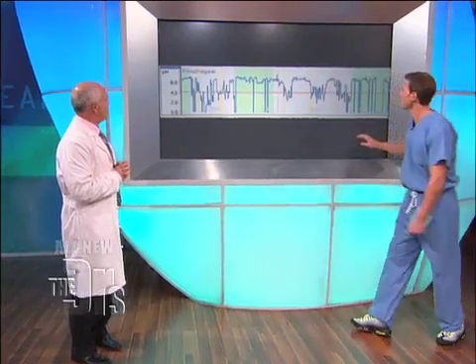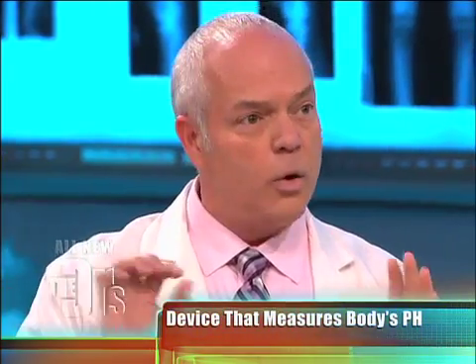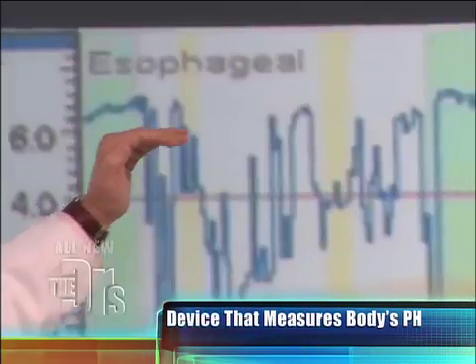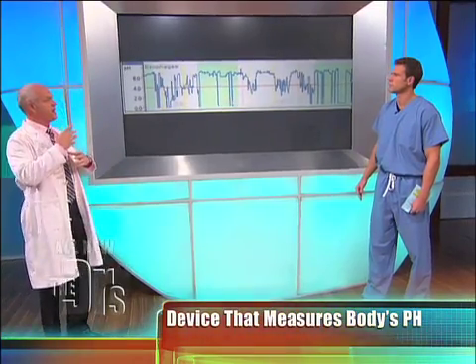So let's talk about the readings here. This is a reading of what's happening 24-7. In the meantime, you're also writing down what is happening during those two days. Here is the normal pH at four. Notice these spikes — those are the bursts, those are the volcano bursts of acid coming up.